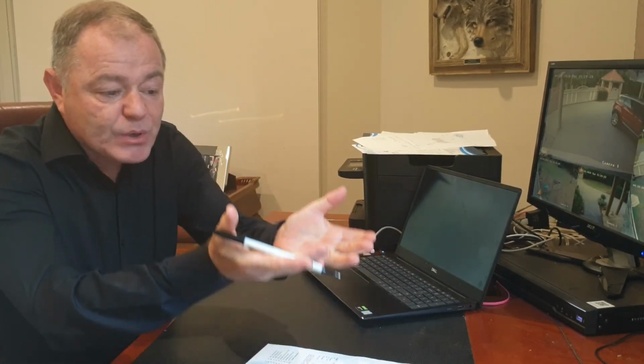But the brain's amazing in terms of how it will adapt. It just needs to be given the opportunity, which means all you've really got to do is wear the hearing aid, everything will settle down, the brain will adapt, and then we'll be able to gradually bring your hearing back up as close to normal as we possibly can. So these days, most people are able to get a very high degree of benefit from the use of a modern hearing aid.